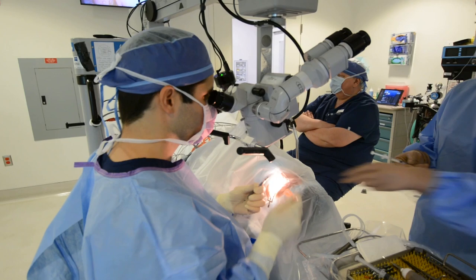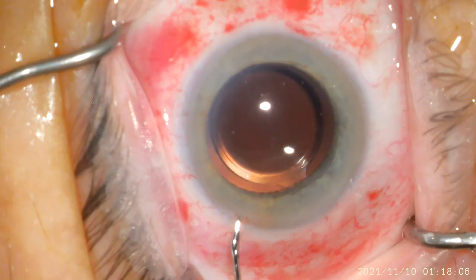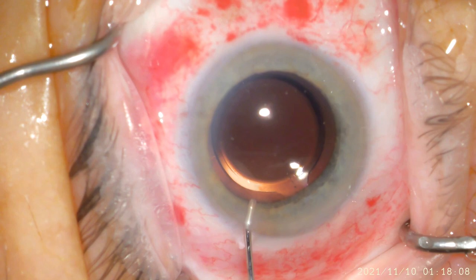In this particular case, the patient has opted for a custom vision package, and I am using a toric IOL, which will allow me to correct all of this patient's astigmatism.